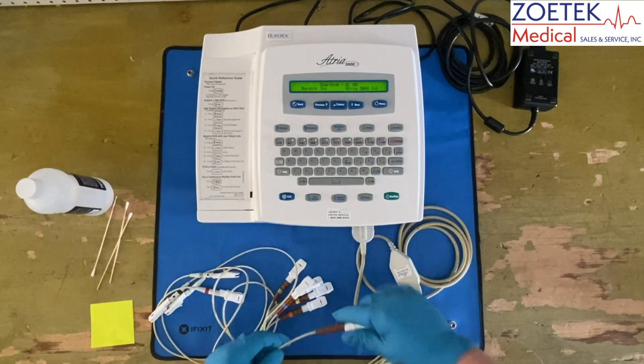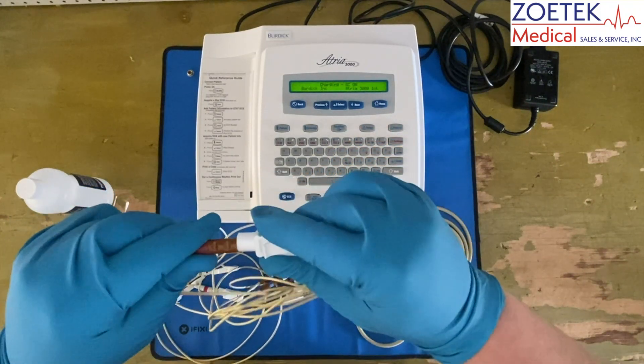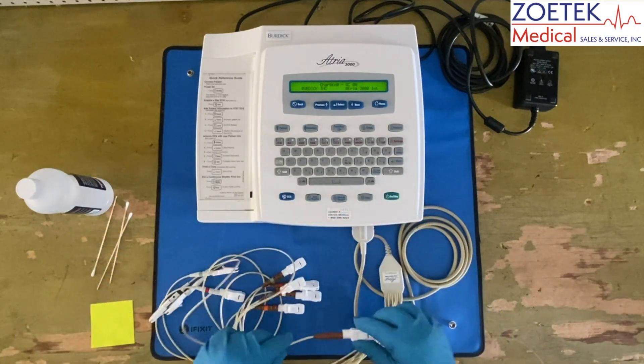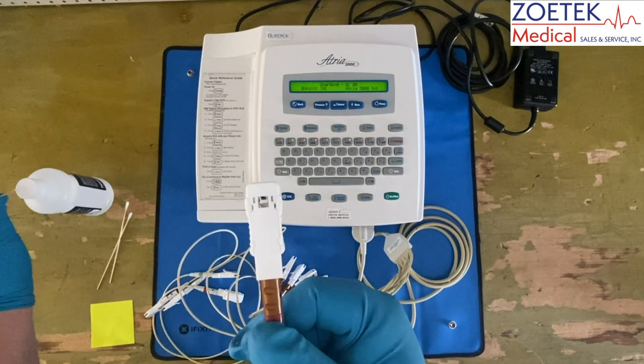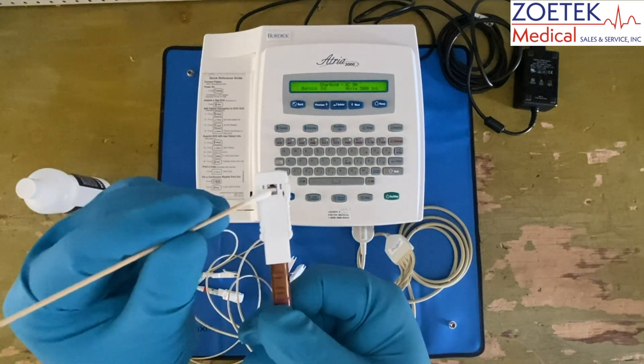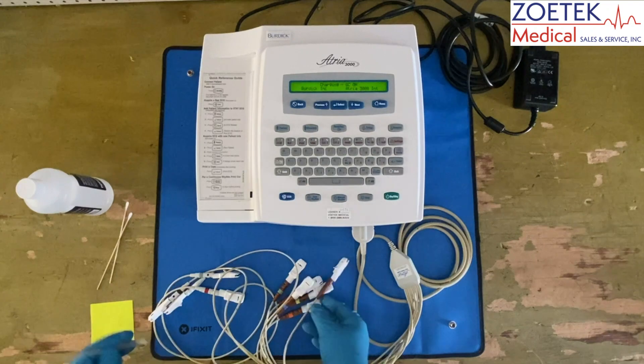Check the patient lead clips for any damage and ensure all of them are tightly secured to the leads. These clips are susceptible to a buildup of adhesive as they make frequent contact with the electrodes placed on patients. Use a non-abrasive cleaner, such as alcohol, to clean the affected clips.